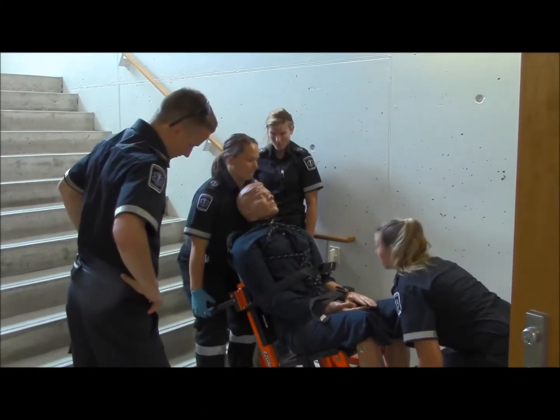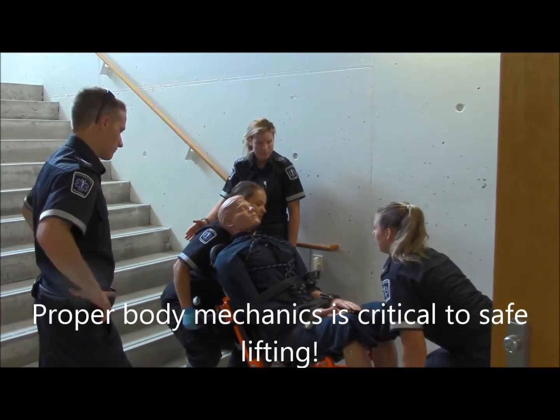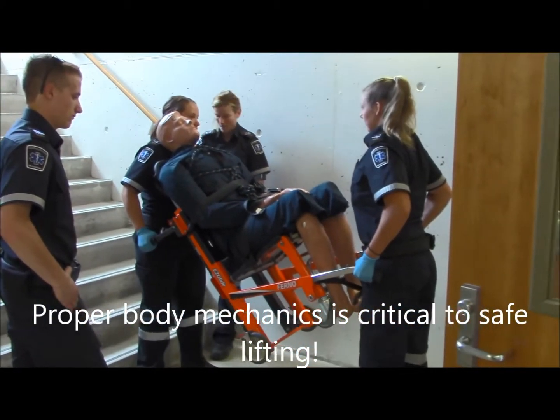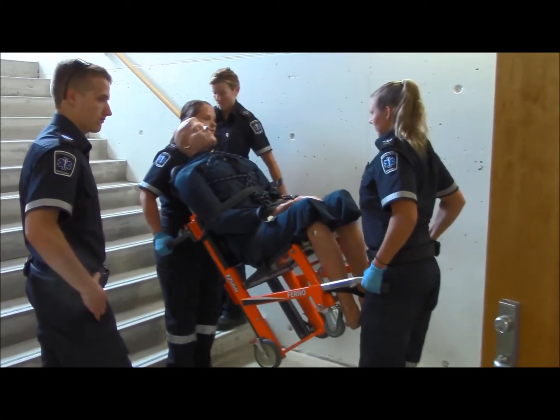Part 1 is using the stair chair, also known as the lifting chair, as it can be used for situations not involving stairs. Using proper body mechanics and safe communication strategies, you'll be required to lift the mannequin both from the head end and the foot end of the stair chair.